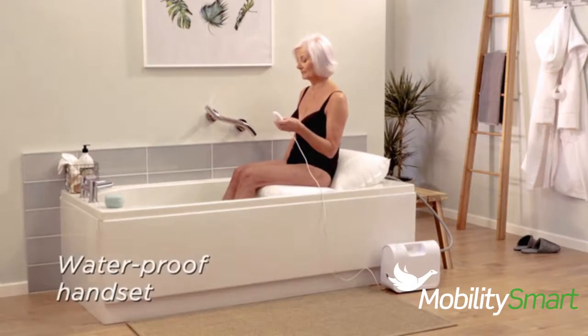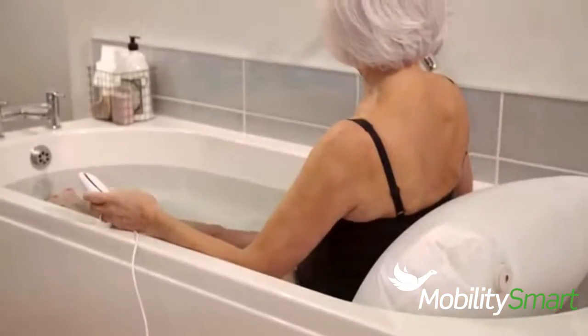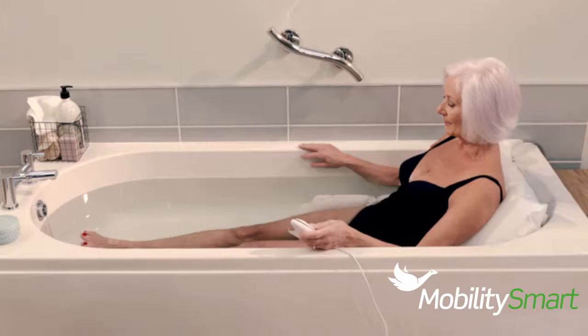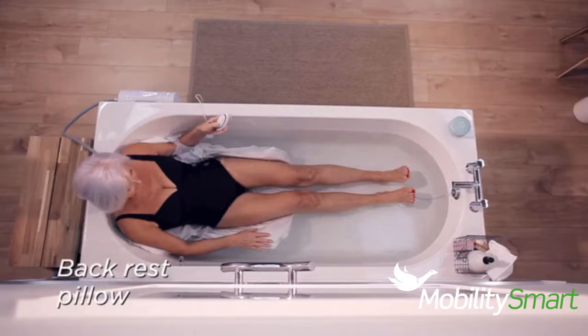Once in a stable position, use the waterproof handset to deflate the bath lift. The bath lift will not lower you into the bath unless there is sufficient charge in the compressor to get you back out. Fully deflate or keep some air in the backrest pillow.